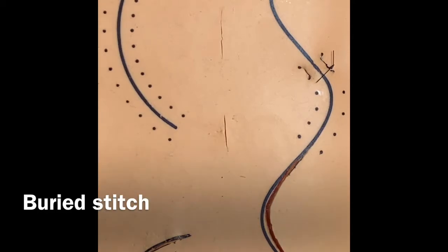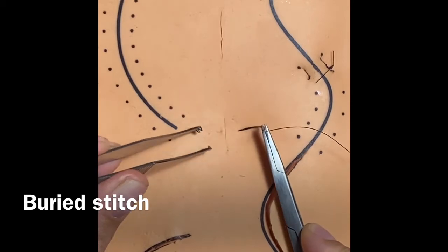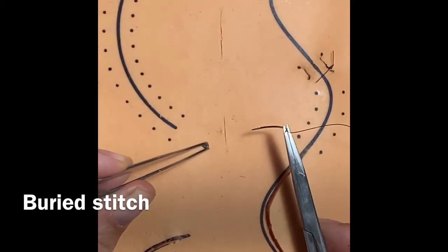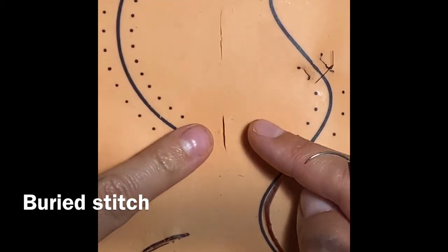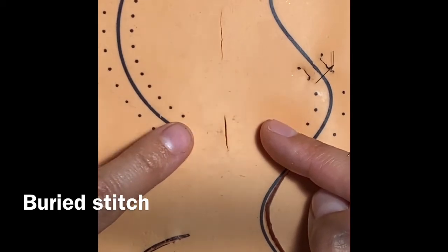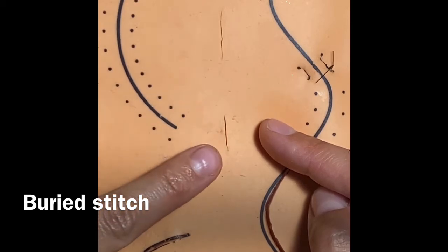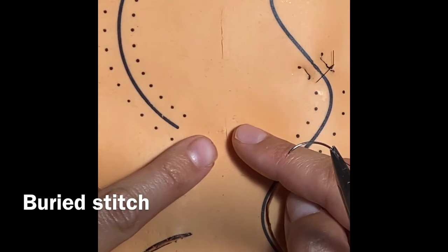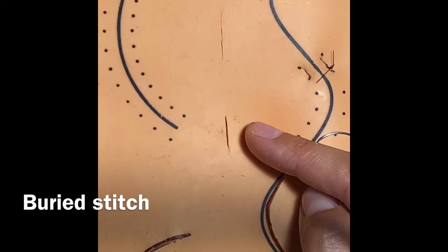This stitch is a buried interrupted stitch, and the way to remember this one is deep to superficial, superficial to deep. Often laparoscopic and robotic incisions are about 1 centimeter in length. And because they're surgical incisions, we use absorbable sutures like Vicryl or Monocryl. And because they're absorbable, we want them to be below the skin surface. So as the patient's wound heals together, the stitch absorbs and breaks down over time, and the patient never has to have a stitch removed.